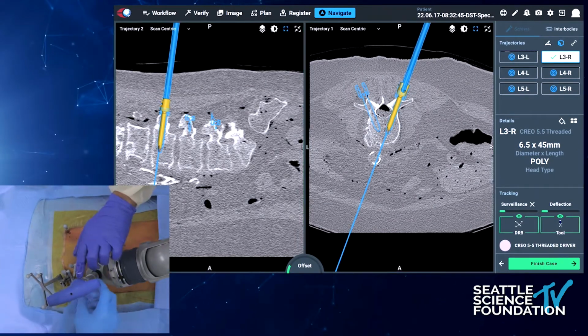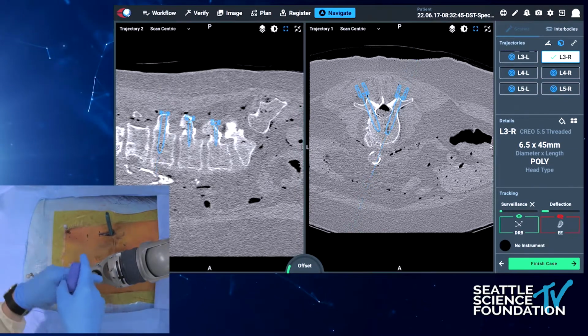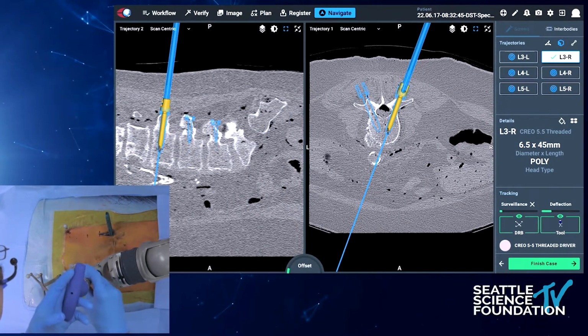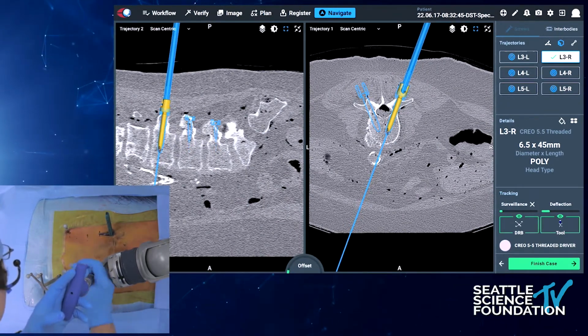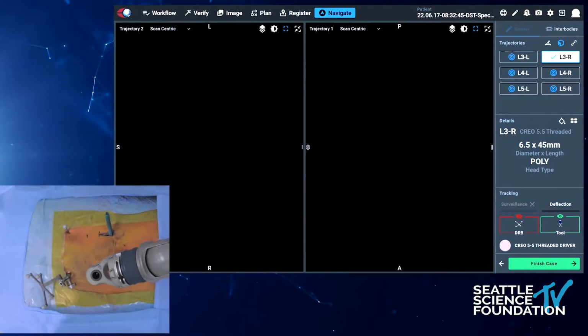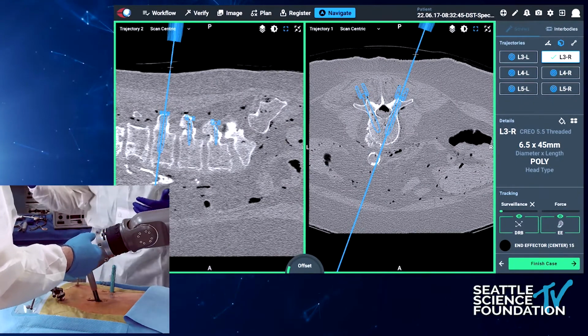So here you can back off the screw by a little bit. Okay. That's it. And then you always have the ability to re-drive that screw down later. So in this situation, yep, there it is. He was able to do it. If he wasn't, then we could just take the end effector off, and it makes it so simple.